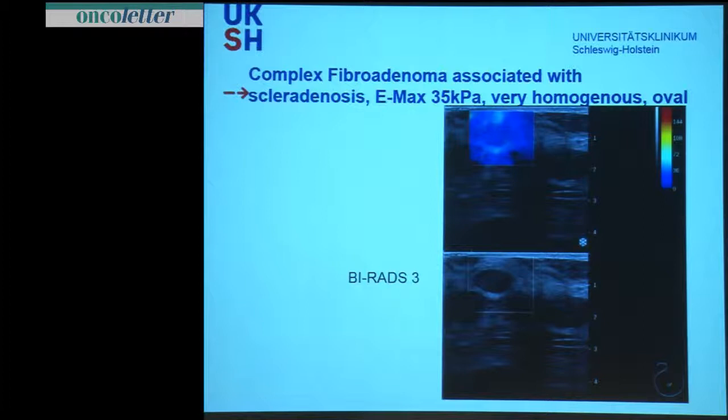Another case: a hypoechoic lesion, very well defined — a BIRADS 3 finding. In the region of interest there is an overall blue tone, very homogeneous shear wave appearance, an oval lesion. E-maximum was 35 kilopascal. This was biopsied and turned out as a complex fibroadenoma combined with a sclerosing adenosis.